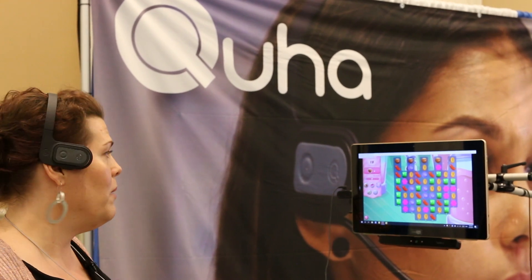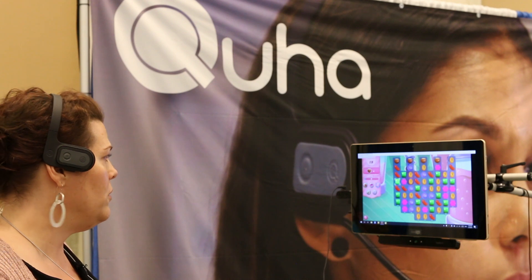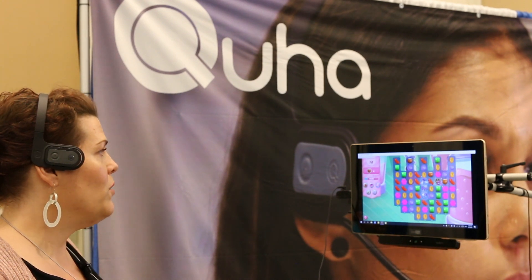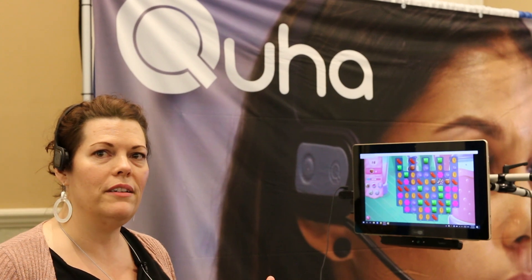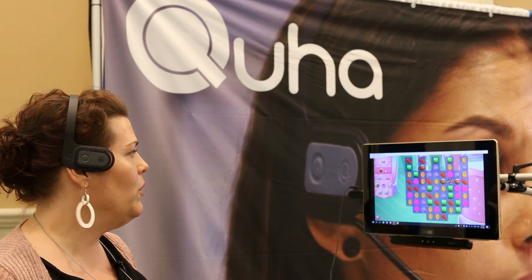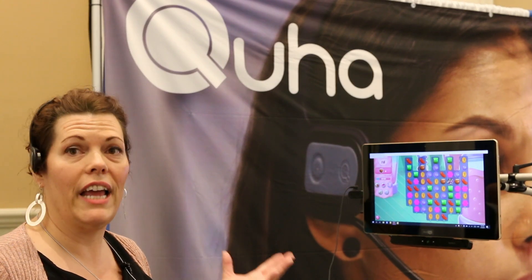You'll see here that I'm demonstrating how I'm using the mouse. I'm just using a little bit of movement and it's reading — it's following my natural head movements rather than having to be looking at a camera.